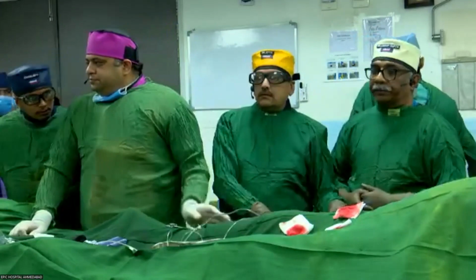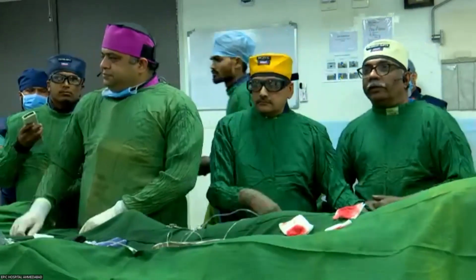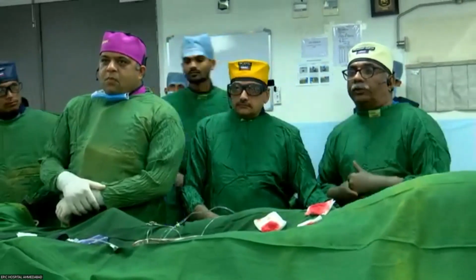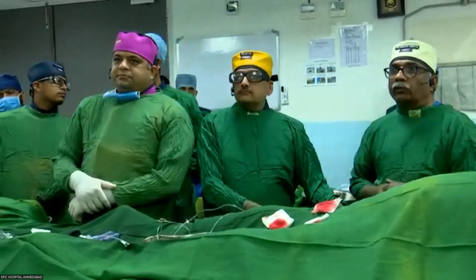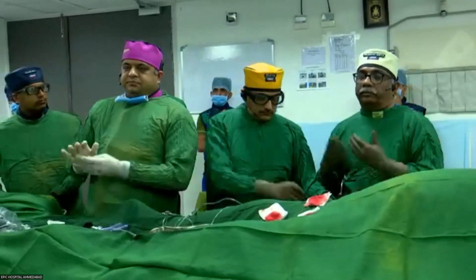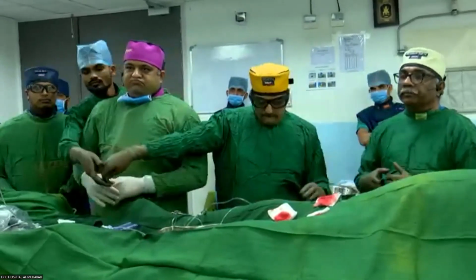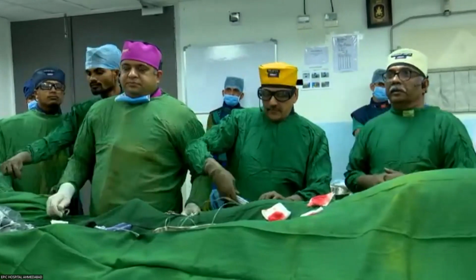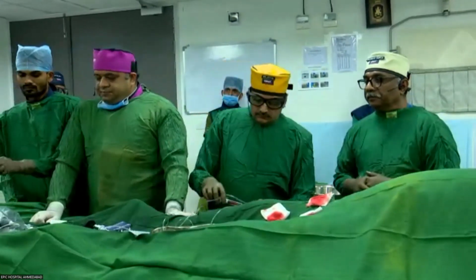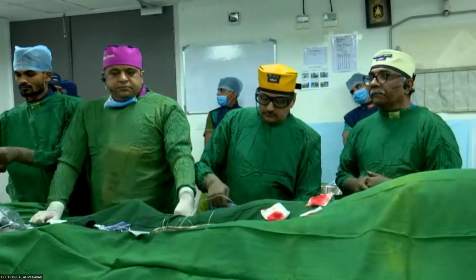Final word. Thanks a lot. Obviously, the question which came, whether it was crossover from LMCA. Initially we thought that probably we will land up doing a crossover from LMCA. But there is no harm done. You please check the OCT again, what was the diameter. Now I think it is wonderfully done and we are just winding up.